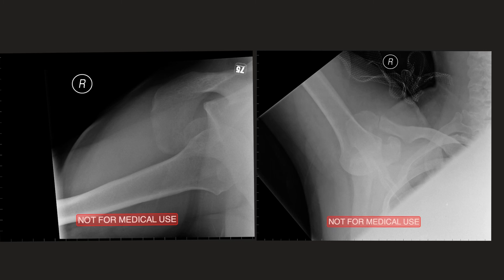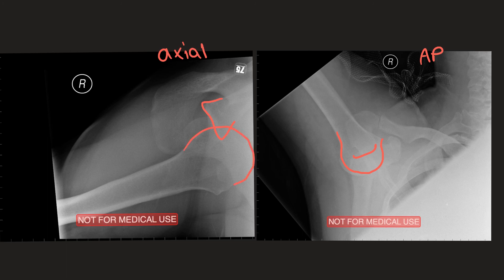On this last case, on the right we have an AP film and on the left an axial film. You can see that the patient has presented with their arm abducted and the humeral head has moved inferiorly in relation to the glenoid. This is in keeping with luxatio erecta. On the axial film, you can see that the glenoid is not at all congruent with the humeral head.